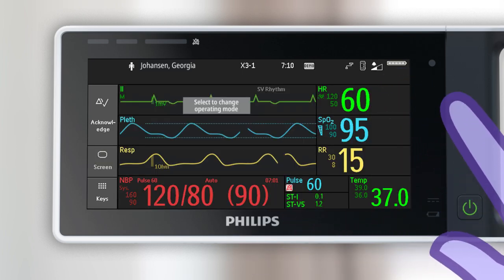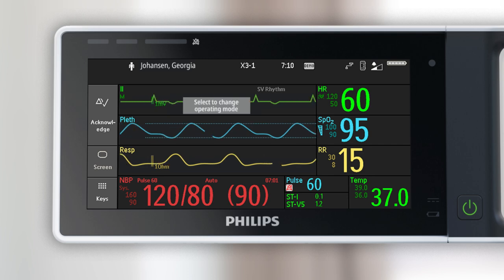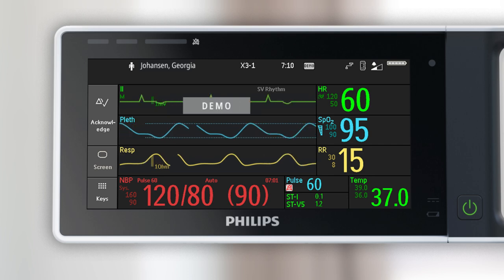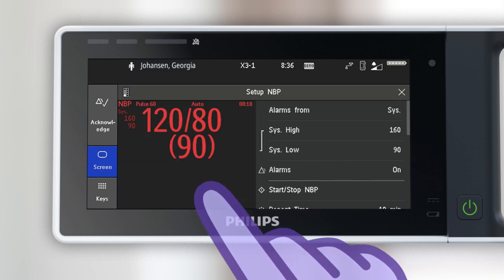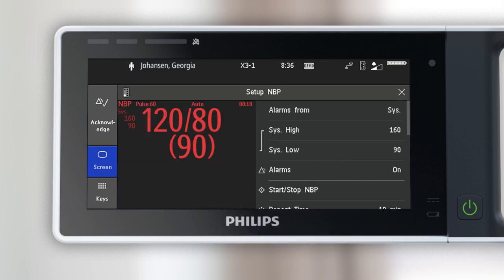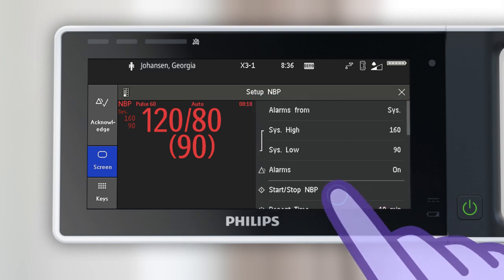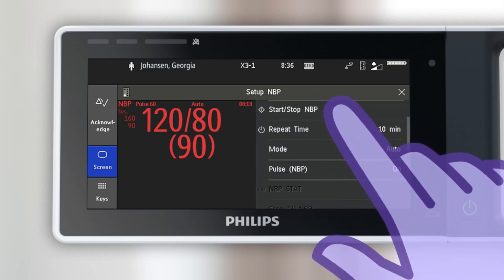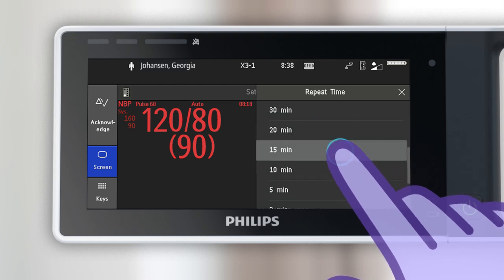Measurement settings can also be adjusted from the main display. To open the menu for a specific measurement, touch the waveform or numeric. The setup menu for the measurement opens with a list of settings for that measurement on the right. Use your finger to scroll through the menu and touch a specific setting to view additional options.